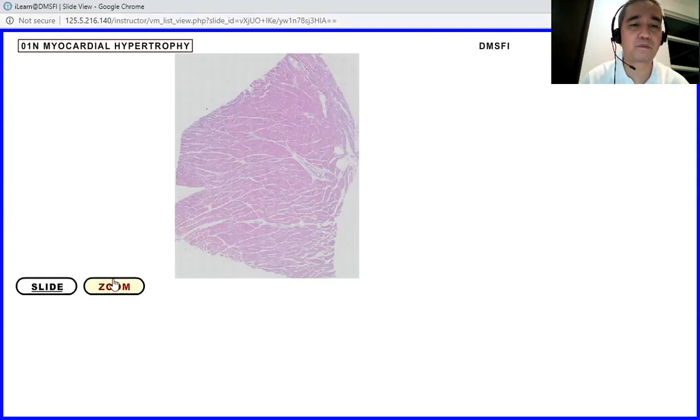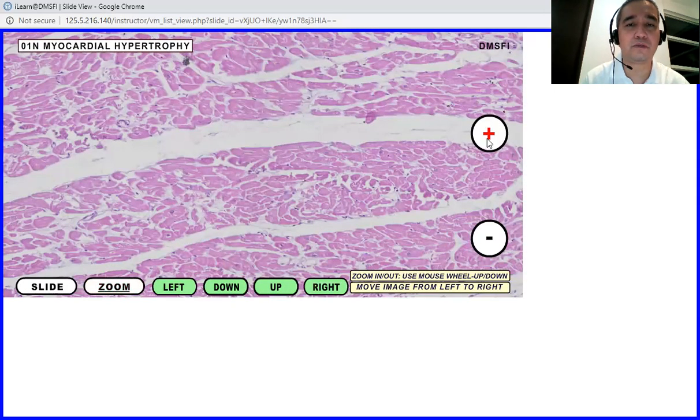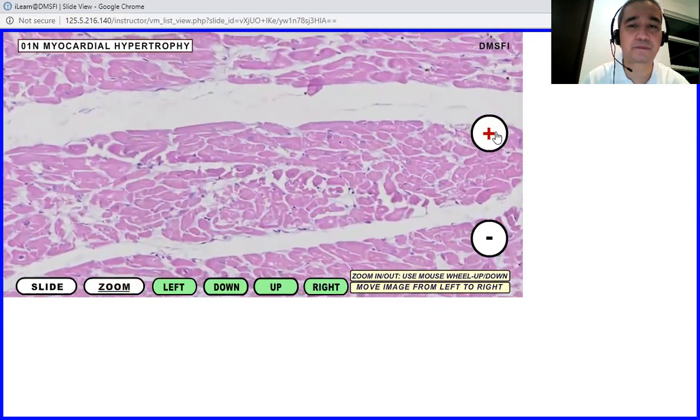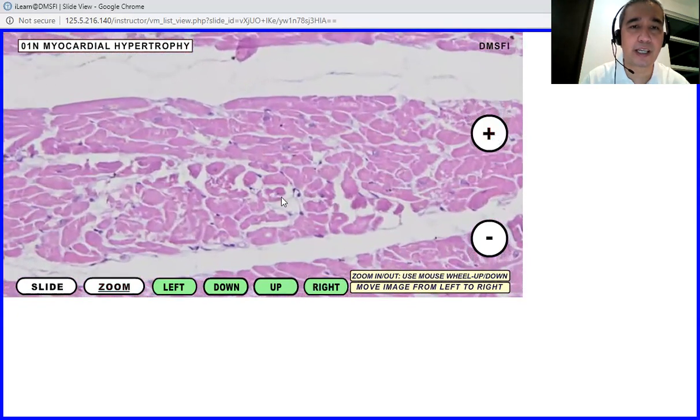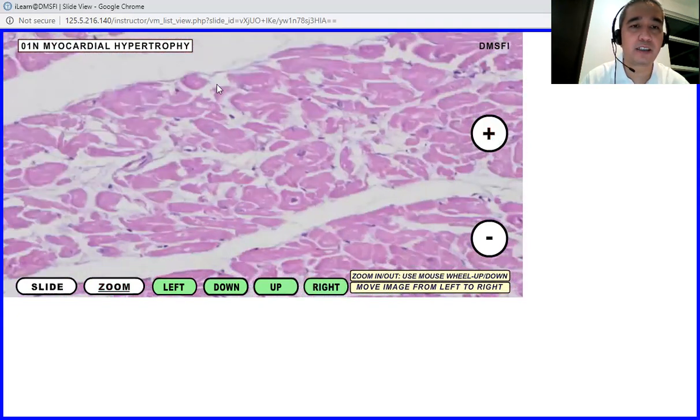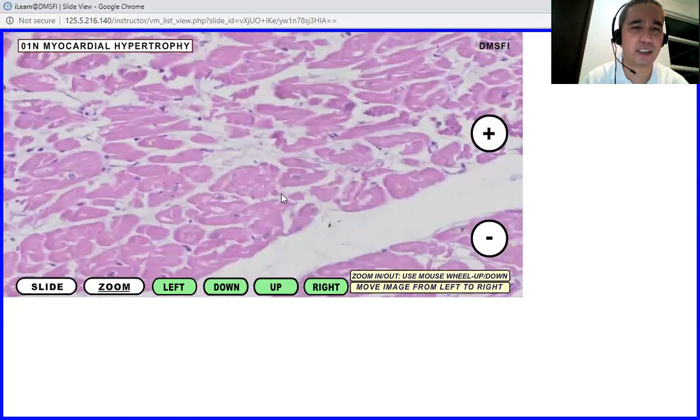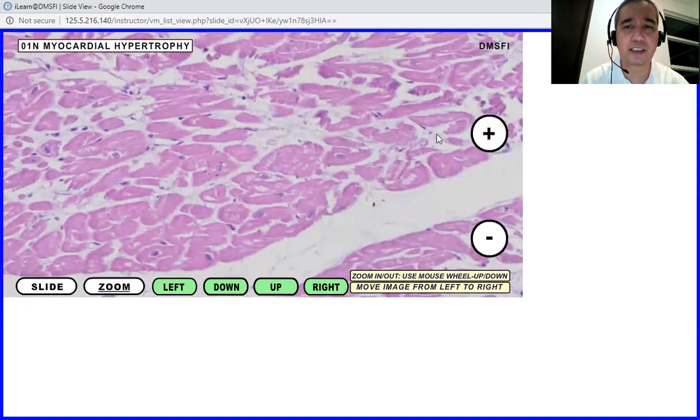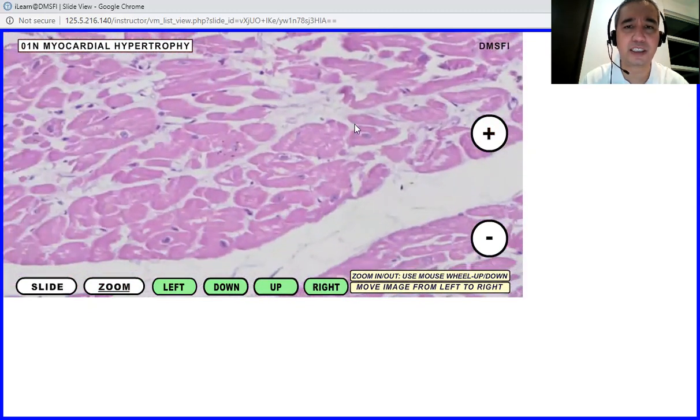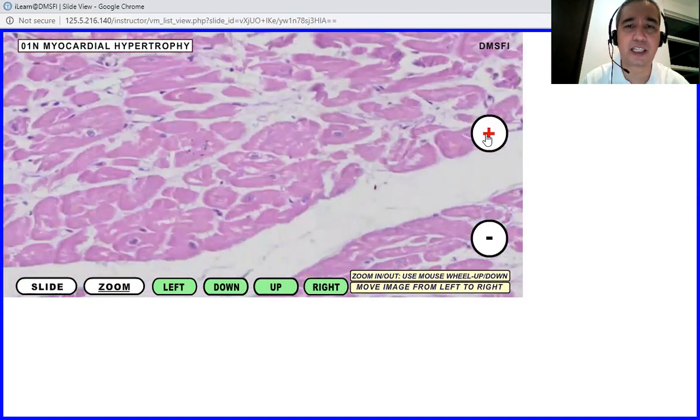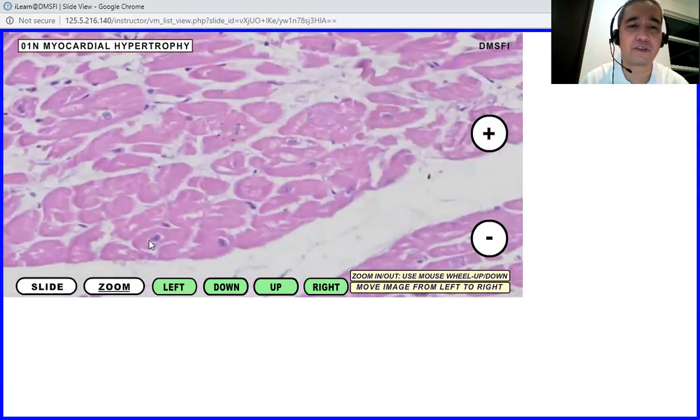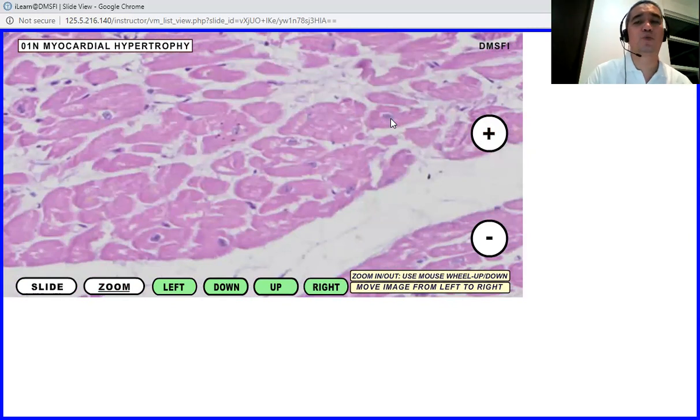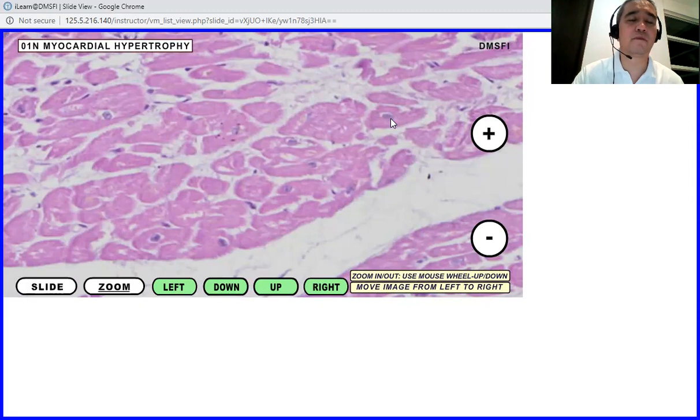You zoom, okay, the slide, and voila. You magnify them. So this is a cardiac myocyte. What we need to identify would be for the presence of enlarged myocytes. Actually, these are all enlarged myocytes. This is identified with an increase in the thickness of the myocyte or the muscle fiber, as well as an increase in the size of the nuclei.